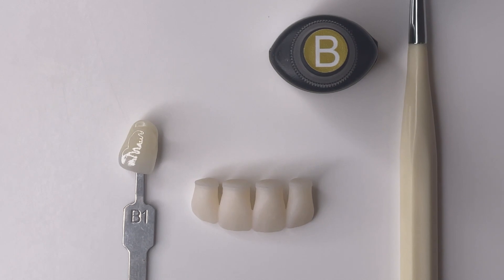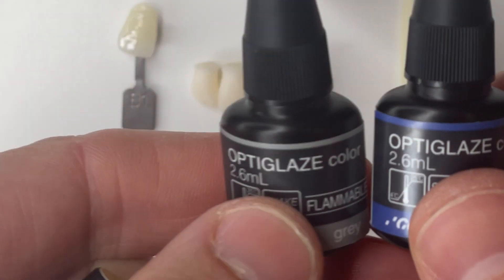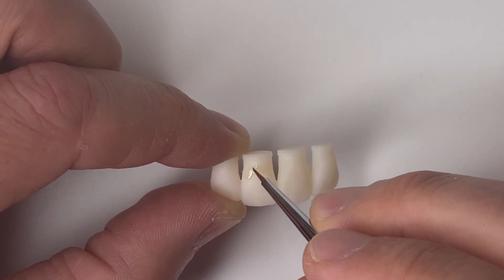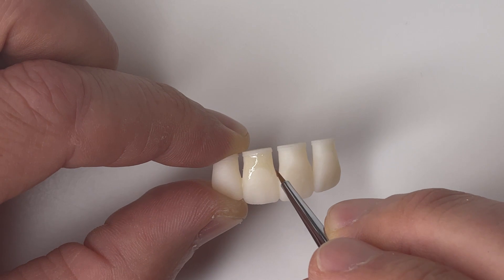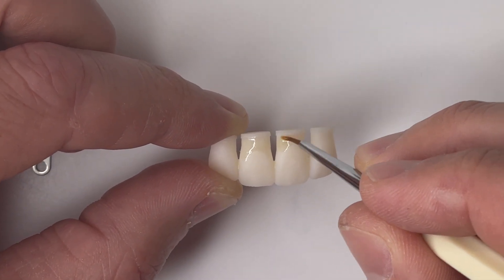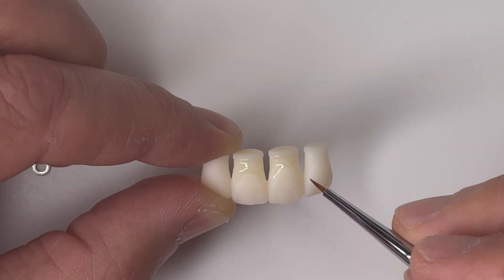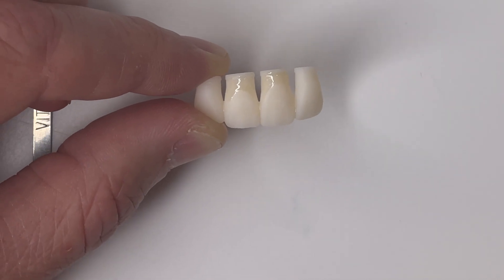Now we're going to transition to the anterior. I want to show you on some anterior teeth how to add chroma to make this bleach shade set of teeth — I'm just going to do the centrals — to make them a B1. Same thing: we have B Plus Opti Glaze, our shade tab as reference, and our brush. I'm also going to add a couple of other things to make these look more realistic: a little bit of gray and blue to the incisal edge to give a hint of incisal translucency. Starting in the cervical third, and since these teeth are attached I'll also put extra chroma in the interproximal area, as you would expect on a three-unit bridge. Always start in the areas where you want the most chroma.